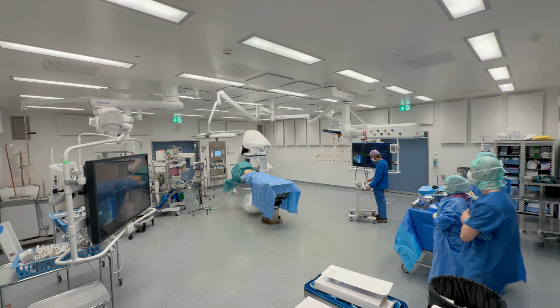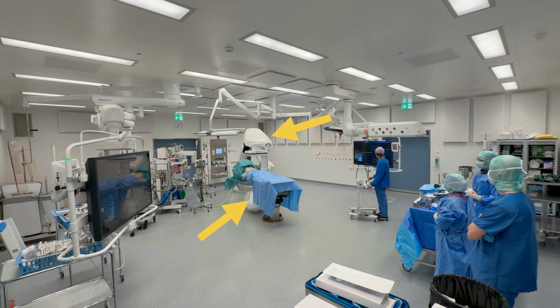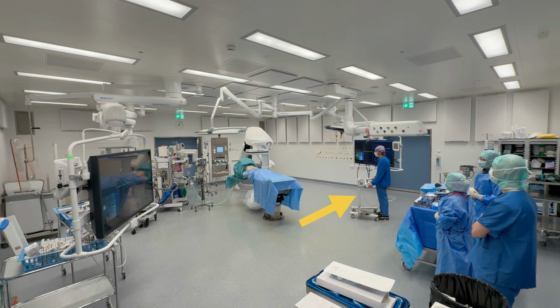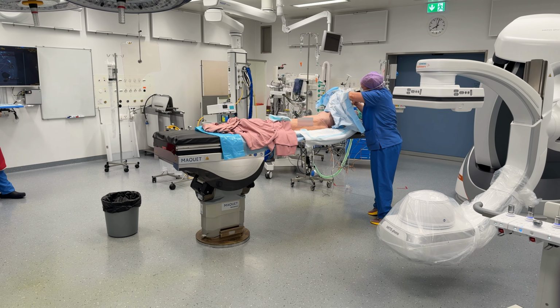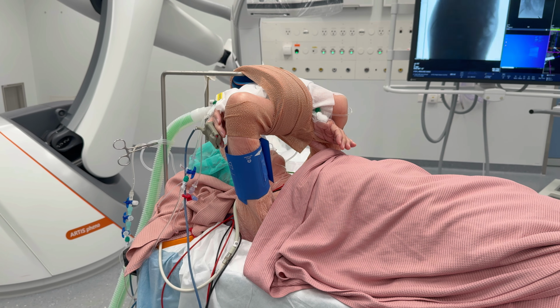The setup consists of the X-ray on a robot arm and a synchronized table. It is managed by an operator on a control panel. Two large screens show the acquired images with the planned screws as overlays. Let's begin the procedure in a 90-year-old female with a fragility fracture of her pelvis.